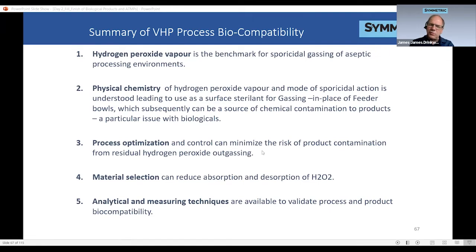This is why we can gas rooms without too much concern about containment risks. If you fumigated a room with formaldehyde and there was a leak at a door, and this room was in the middle of a facility, you probably would even smell the formaldehyde when you walked into the facility. It diffuses that readily.